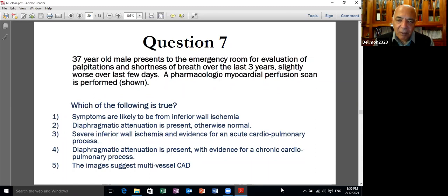That's not enough. الستيتش ترايل which is a major trial, الانتقاد الشديد اللي ليها was done about 10 years ago. ان هو استخدموا الثاليوم والدوبيوتامين echo for viability. These are not the gold standard. The gold standard is positron emission tomography and detecting perfusion metabolism mismatch or magnetic resonance.